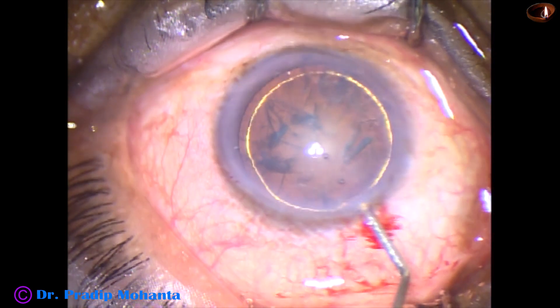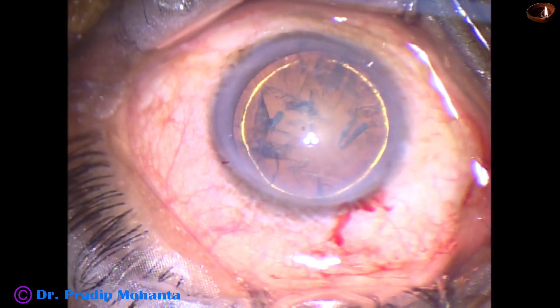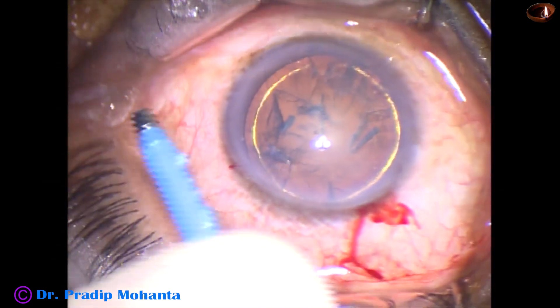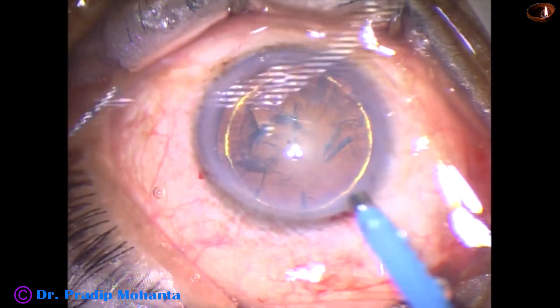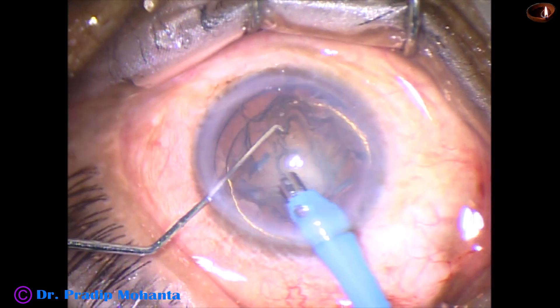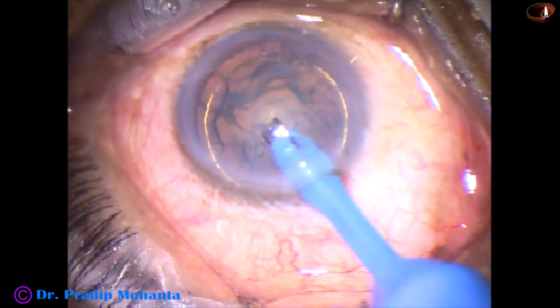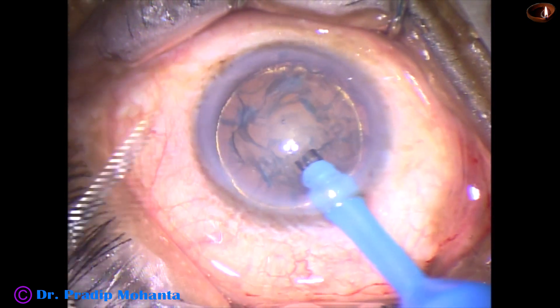Now is the time to go into the eye with the FACO handpiece. The tip of the FACO needle has to be adjusted — the exposed part — and the irrigation should come from the sides. The FACO needle goes in with its bevel down.